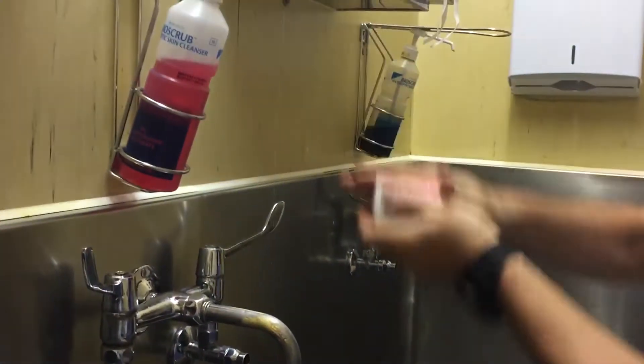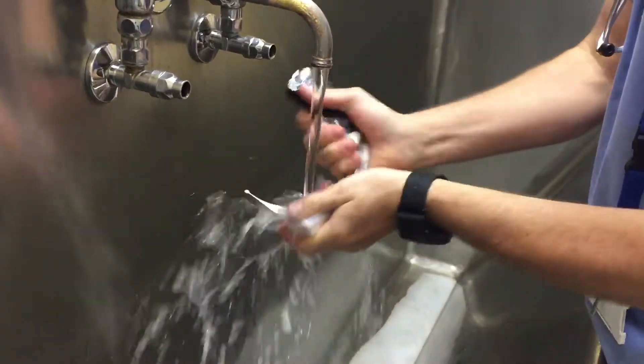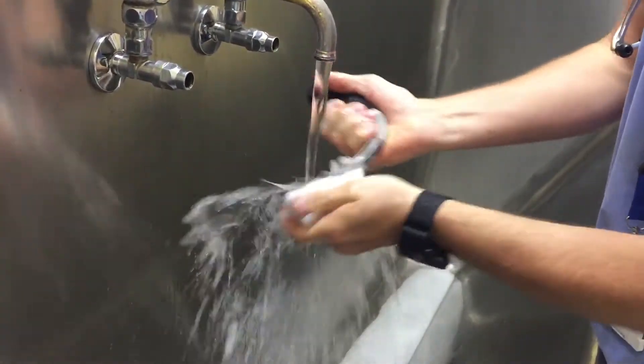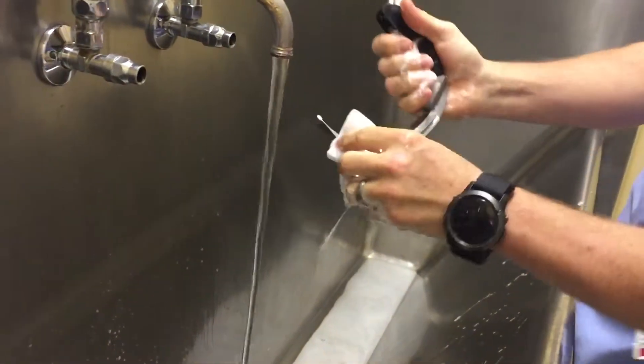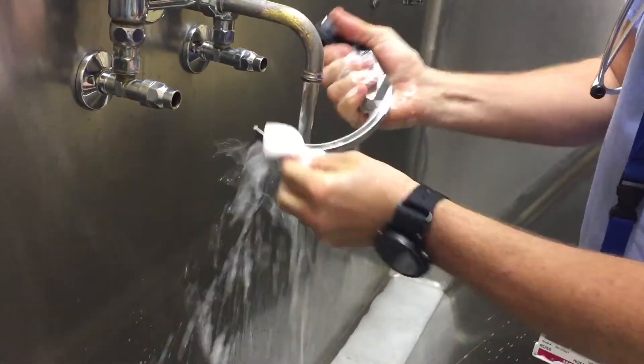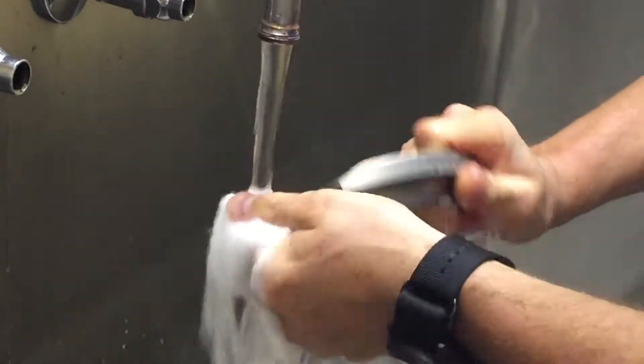Let's get some soap and we're going to clean them. Paying special attention to making sure — as you'll see I'm using the soft part of the sponge — so we're not scratching anything. Making sure that there's nothing stuck in the grooves and there's no particulate matter, blood, saliva, or anything else on here.